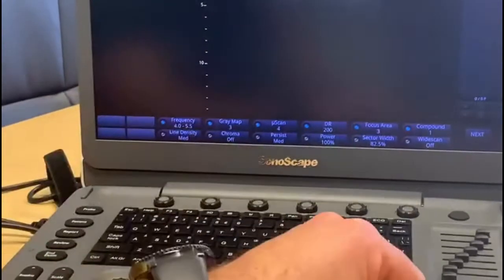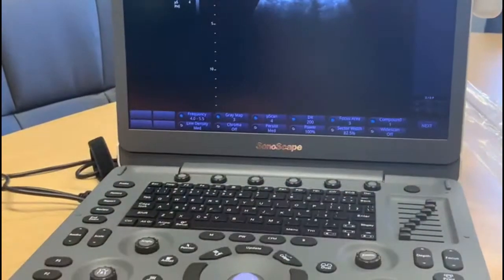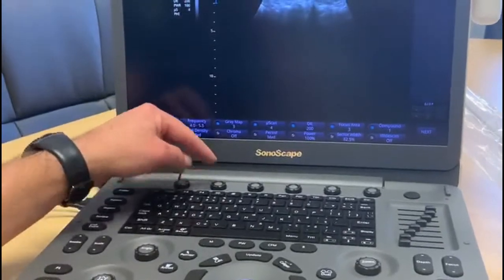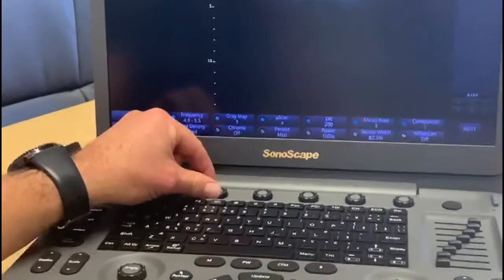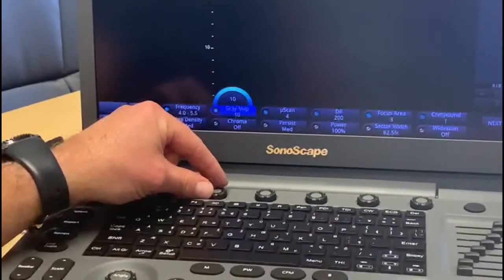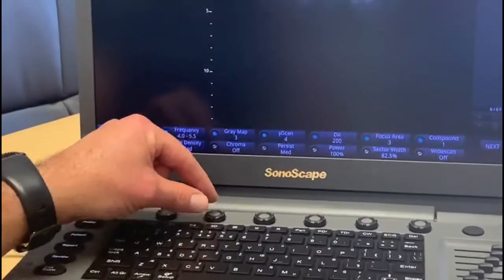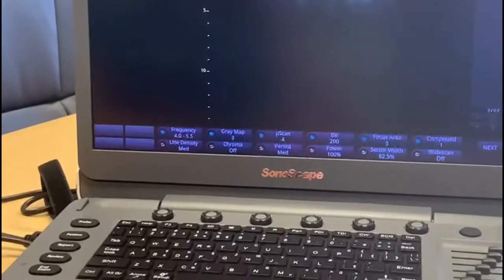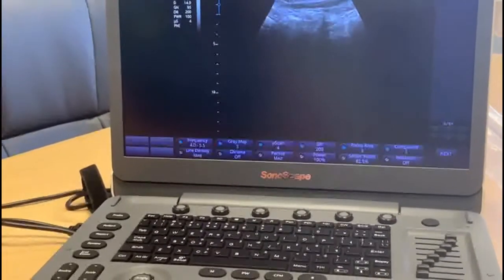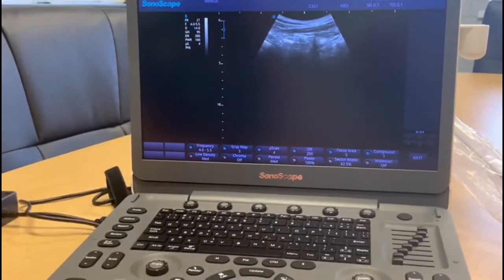As we change the frequency, we may want to adjust the gain again to bring the image in. Another option is the grey map function, which is a global button that changes the grayscale on the screen. It's a case of experimenting depending on what you're imaging to get the right type of black and white image.